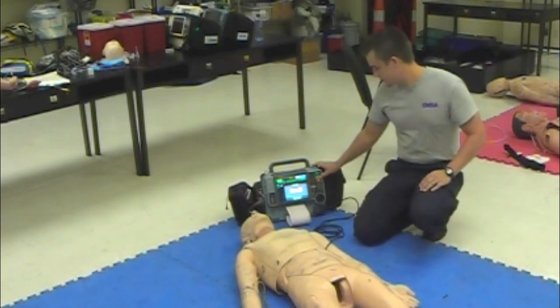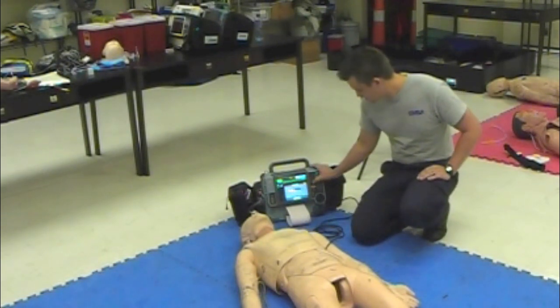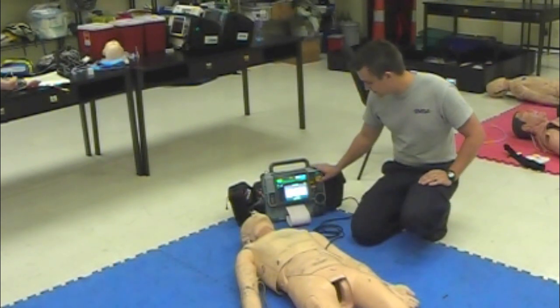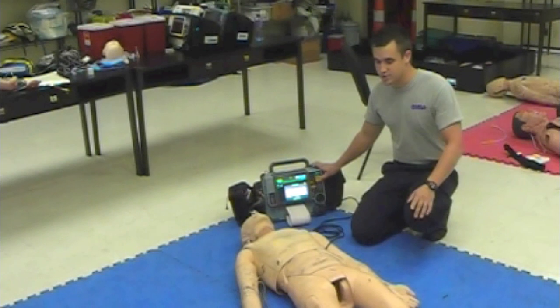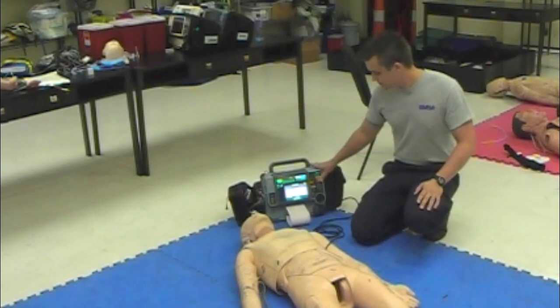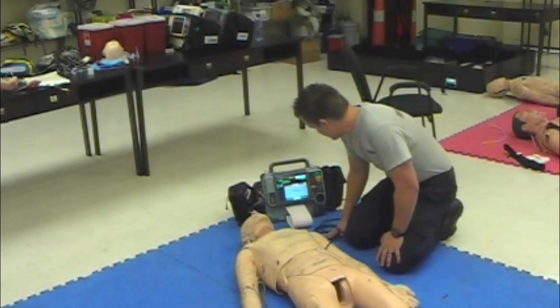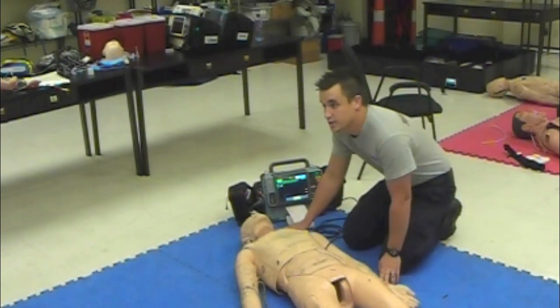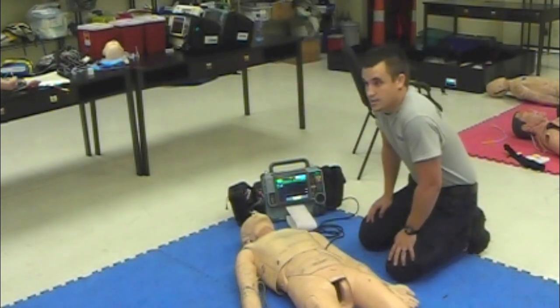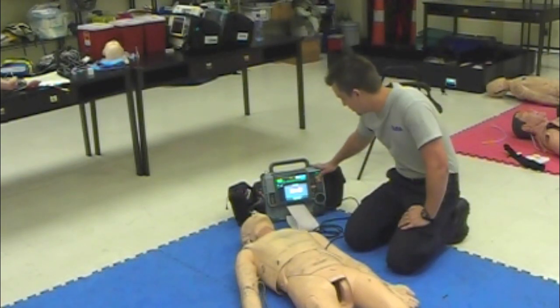Still giving ventilations as I charge it up. Also syncing as I'm doing this. And we're going to shock on 3. Ready? 1, 2, and 3. Okay. So I'm still seeing VTAC. Do I have a pulse with this? You do. Okay, I'm going to give 150 milligrams of amiodarone. Okay. That's going in. Okay, and then I'm going to charge it up to 300.